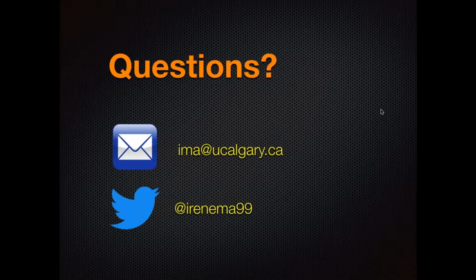But really, I think one of the main things is that you do want multiple resources to help learn this skill. It's not only from a textbook, it's not only from a webinar, it's not only from attending conferences. You want hands-on time with the transducer and really try to get feedback on your imaging so that you know what you're looking at.